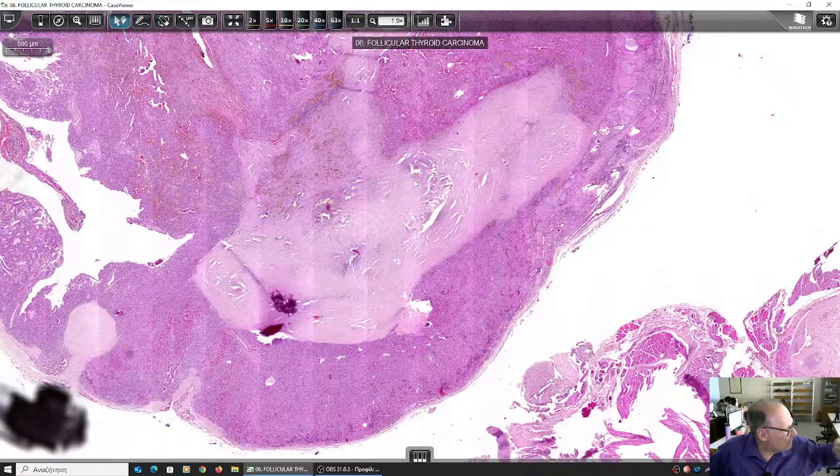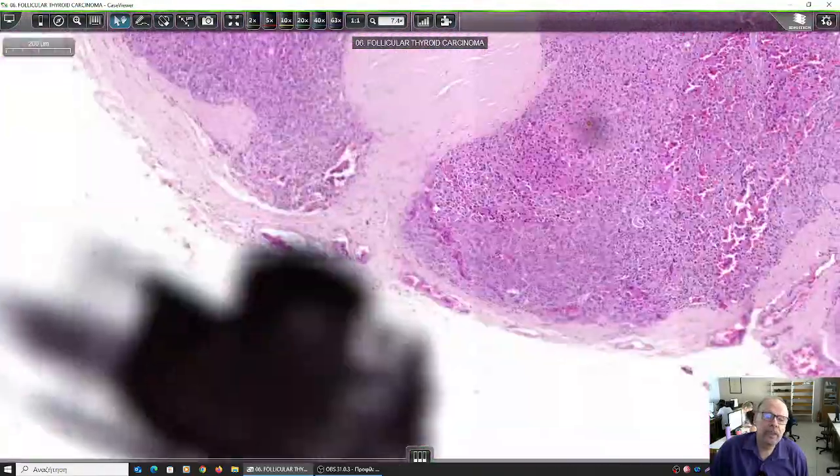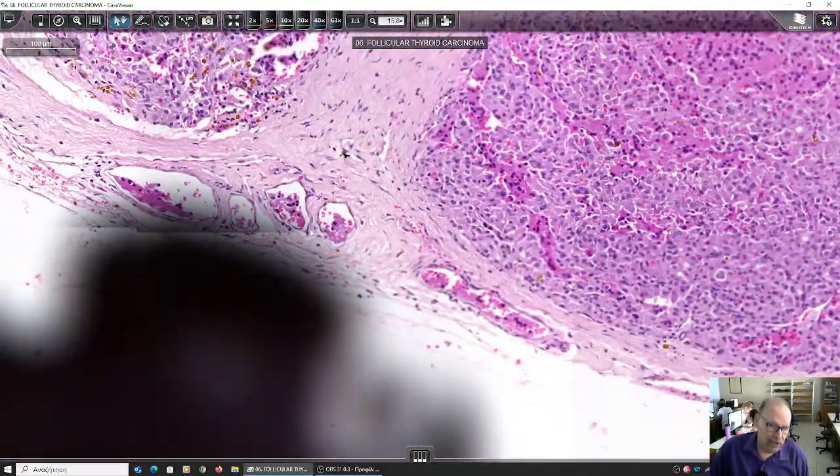because something has happened to the patient, and we should always know. That's why the clinician must cooperate with the pathologist and tell him all the clinical information so that the pathologist makes the diagnosis properly. However, in this area, we have some vessels and we see some epithelial cells within the vessels, so this is suspicious for vascular invasion. And if we find intraluminal emboli, cancerous neoplastic emboli, this is a hallmark of malignancy.